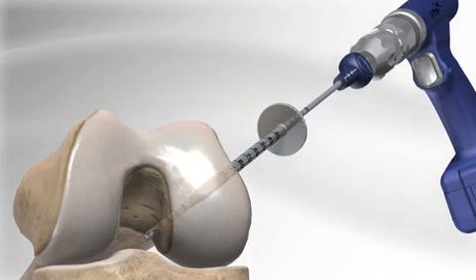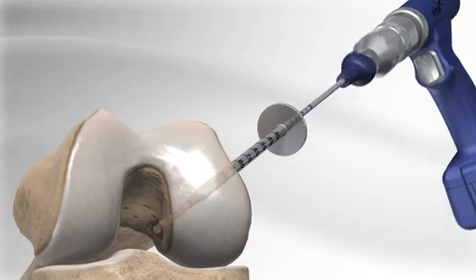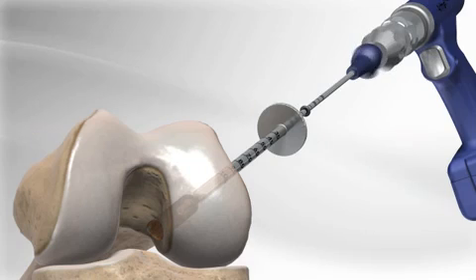By pushing a button on the flip cutter, the tip is rotated into a cutting position. The flip cutter is then drilled back into the bone to create a socket where the graft will eventually be placed. The flip cutter is drilled until it hits the guide, preventing overdrilling.